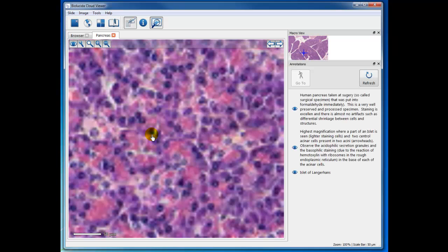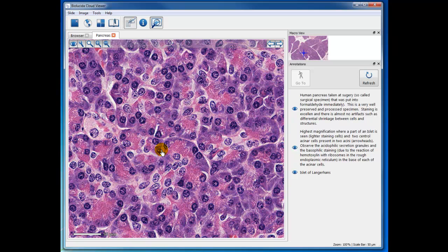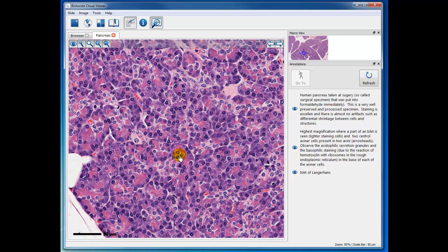If we just zoom in, you can see that it has these serous acinar cells, with the basal part of each cell in an acinus very basophilic, because it's just loaded with rough ER, because it's constantly producing what's in these acidophilic granules, which is pancreatic lipase, which is a protein. It's an enzyme that breaks down lipid chains, small lipid molecules in the intestine, and some other factors.